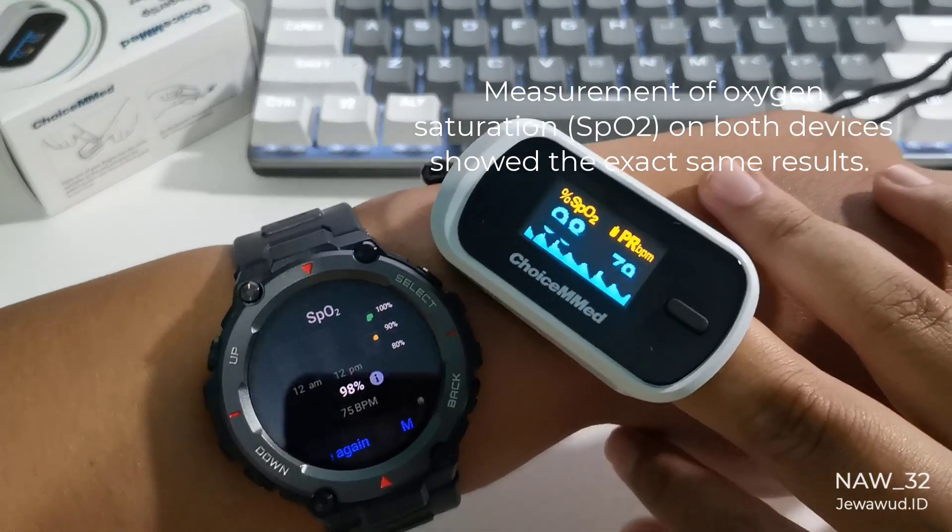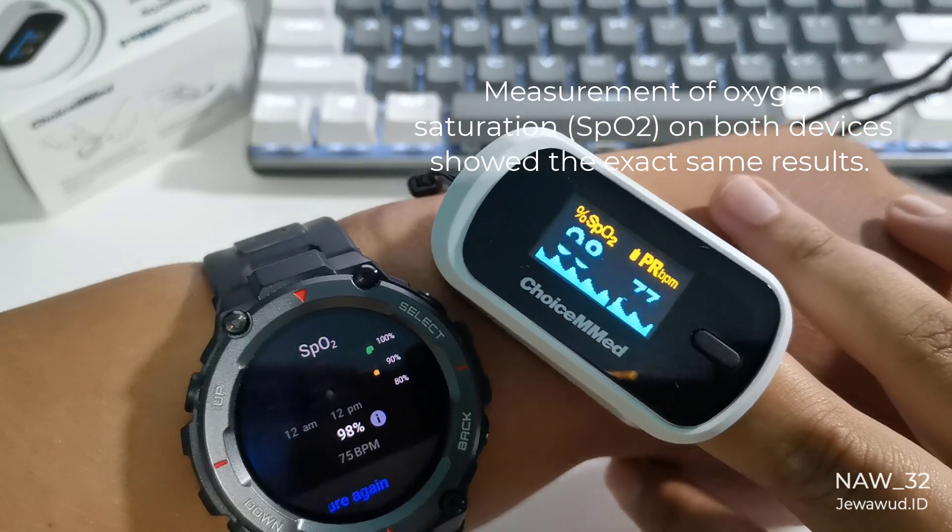On the 3rd measurement of oxygen saturation, SpO2, both devices showed the exact same results.